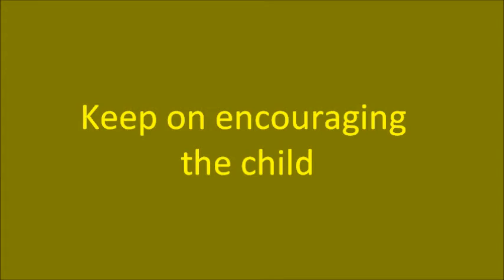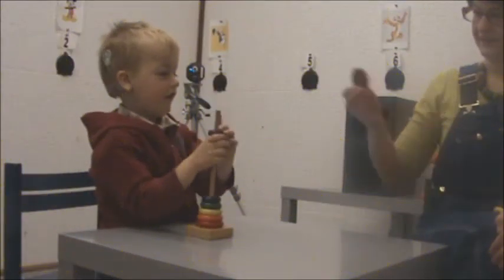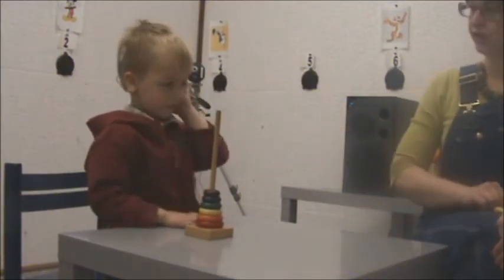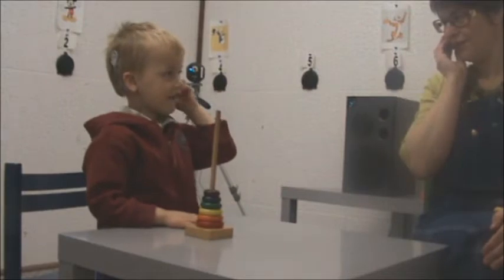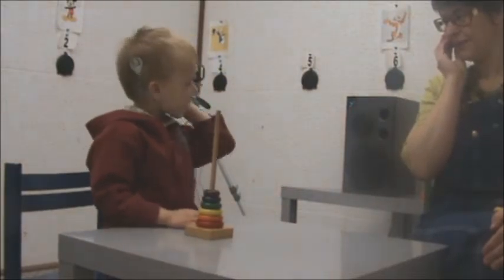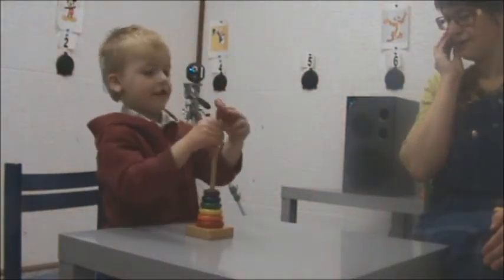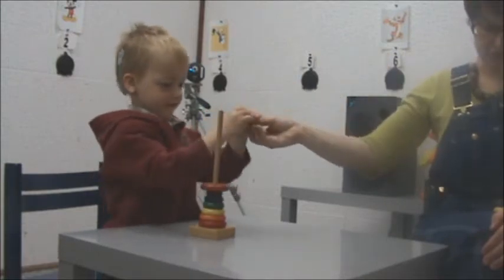This might be the case when the child feels unsure. The distractor has to avoid giving cues on the one hand, but has to encourage the child to show the response behaviour on the other. Jorunn looks up to the distractor because he's uncertain. Because Jorunn showed a lot of false positive reactions in the past, Christine is quite careful in confirming his reaction. When he's looking for confirmation a second time, she encourages him to play the game.